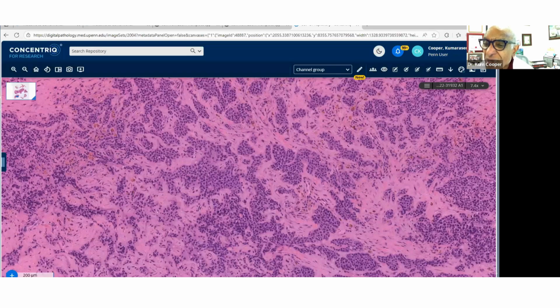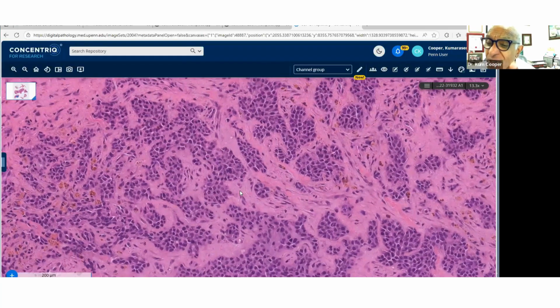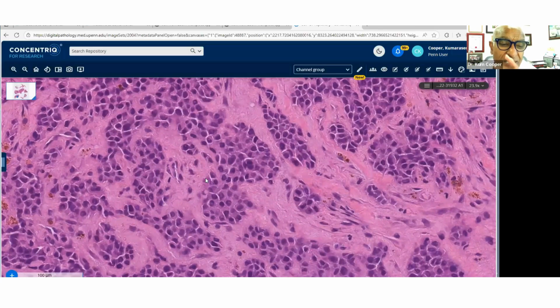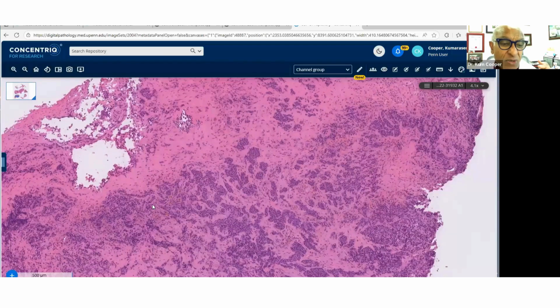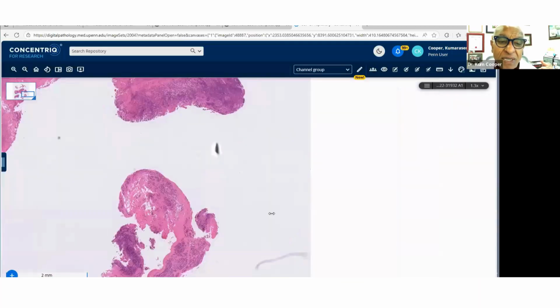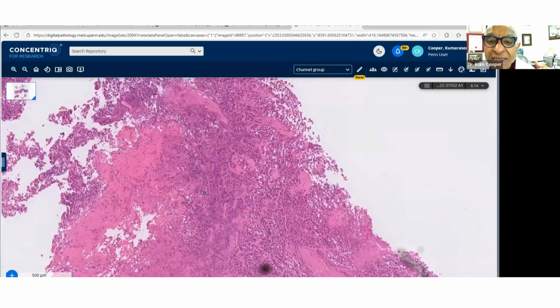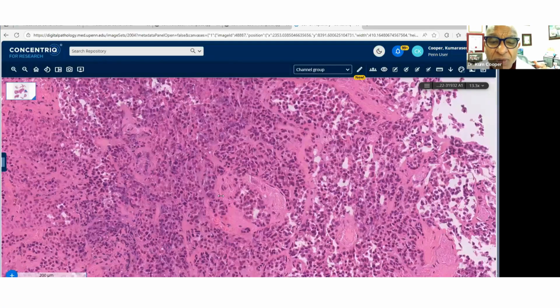There's a Ewing sarcoma here that's been put in as well. Let me stop and pause just to address. I would do the CD99. Don't get me wrong, Michael. I would do the CD99, but the cytoplasm is not quite correct for a Ewing sarcoma. It's too pink. I showed you those. Let's go back to that area I showed you, because the cytoplasm was pretty decent. It's a thin area here. Here we go. And you can see how pink that cytoplasm is.